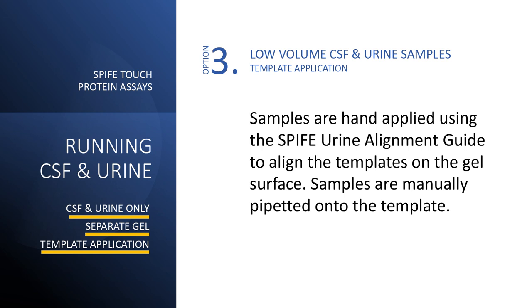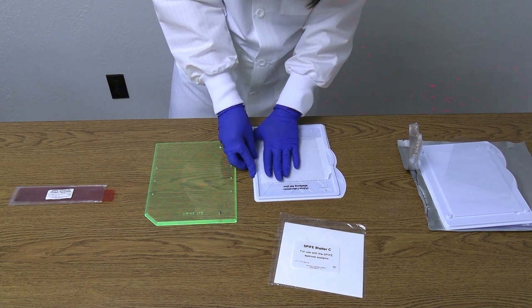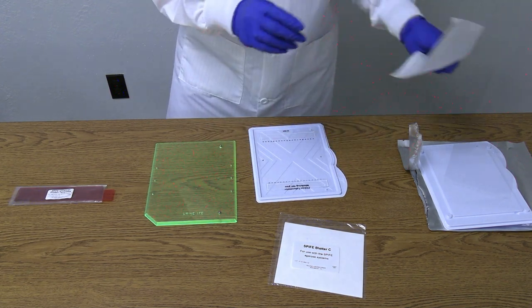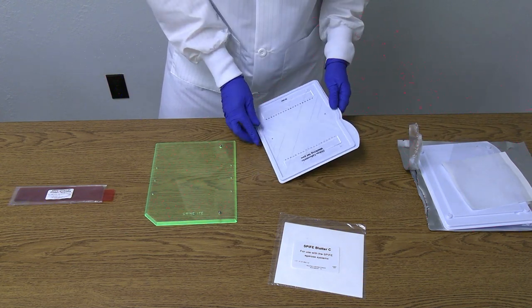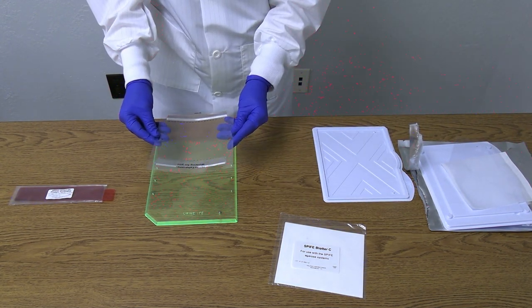CSF and urine specimens with insufficient volumes for automated sample application may be run using template application. The SPIFE urine alignment guide will need to be used to align the templates over the gel surface. After blotting the gel surface with the blotter C, carefully place the gel on the SPIFE urine alignment guide.